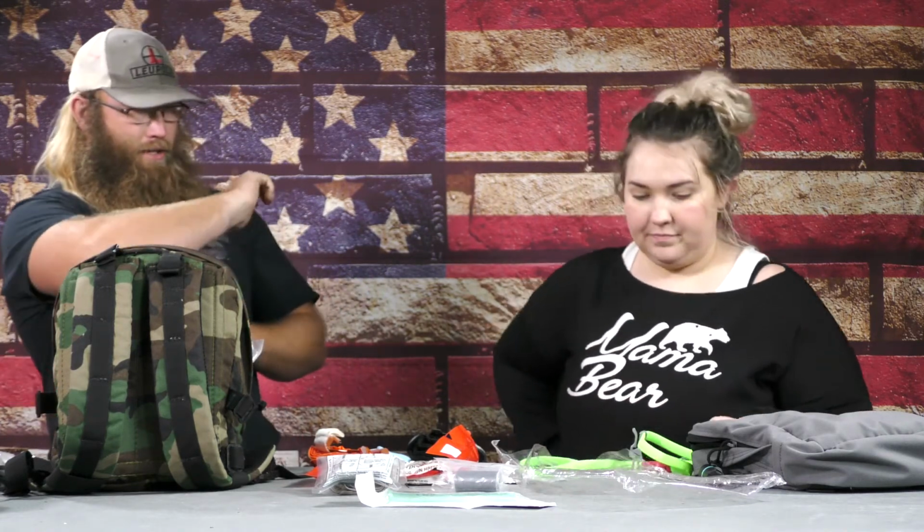Yeah, and he was saying too that older people or people who have carpal tunnel, arthritis, they can work that. Trying to keep the stick with one hand, trying to work that on yourself is not that easy. I've also found that some people who have less hand strength too, they're just better with the rats because of that. It's hard for them to keep that stick going, especially when it gets actually tight. So yeah, that's pretty sweet. Is there any others? I think there's another ratchet style.